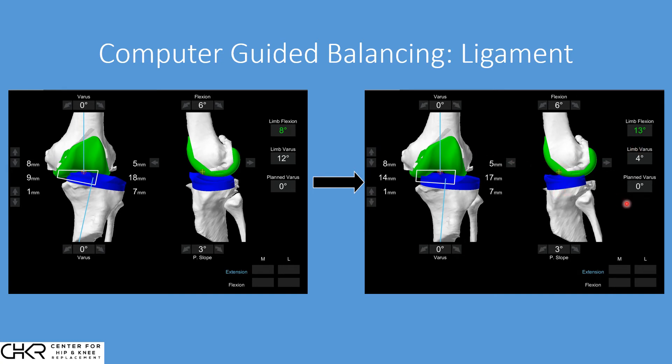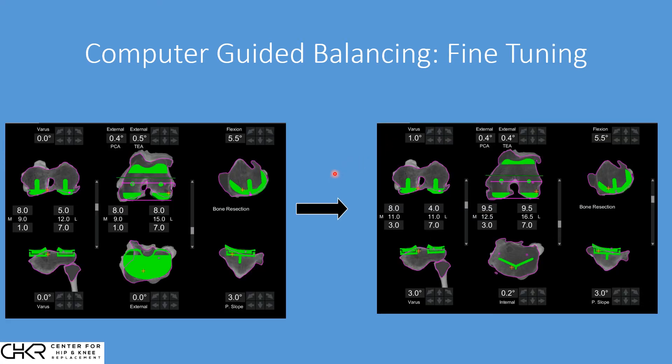We then move to fine-tuning, where we make small micro-adjustments in millimeters and degrees to correct the remaining residual deformity. Remember, we started with anatomic placement — eight millimeters at the femur, seven millimeters at the tibia. We add a little extra angulation on the femur and a little extra angulation on the tibia: one plus three equals four degrees, which is exactly the four degrees we need to correct. Now we're back to neutral alignment. These small degree adjustments are very hard to see visually at the knee, but very easy to dial in by computer.